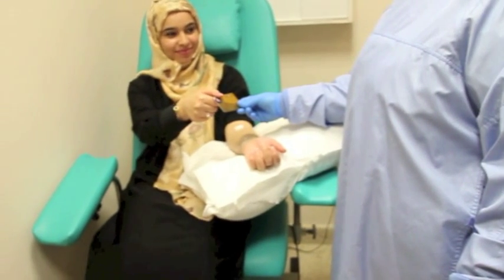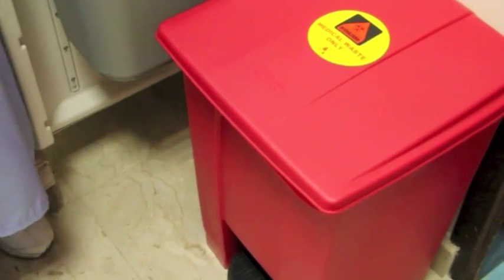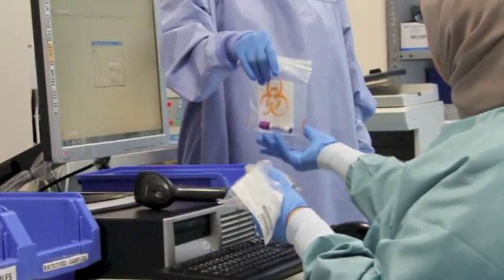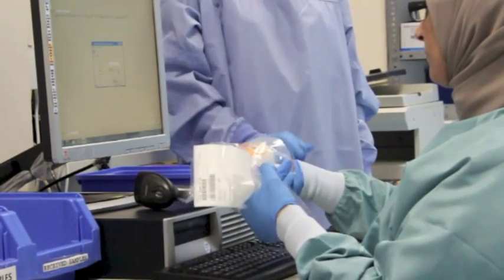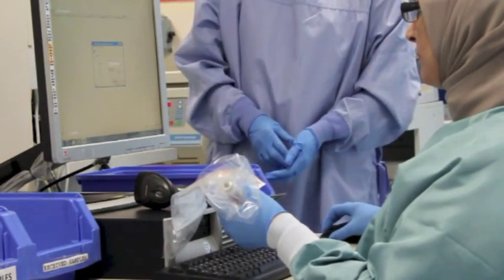Once the patient has been thanked and released, the phlebotomist disposes of the used gloves. And then passes the sample on to be registered in the laboratory information system before being analyzed in the laboratory.